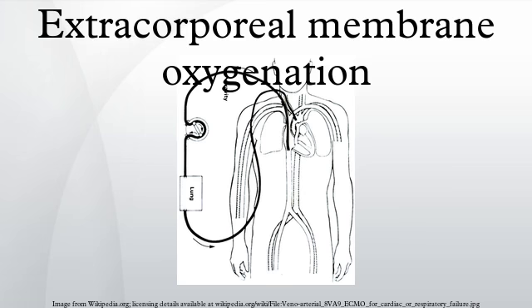Veno-arterial ECMO liberation trial: VA-ECMO trials require temporary clamping of both the drainage and infusion lines, while allowing the ECMO circuit to circulate through a bridge between the arterial and venous limbs. This prevents thrombosis of stagnant blood within the ECMO circuit. In addition, the arterial and venous lines should be flushed continuously with heparinized saline or intermittently with heparinized blood from the circuit. In general, VA-ECMO trials are shorter in duration than VV-ECMO trials because of the higher risk of thrombus formation.